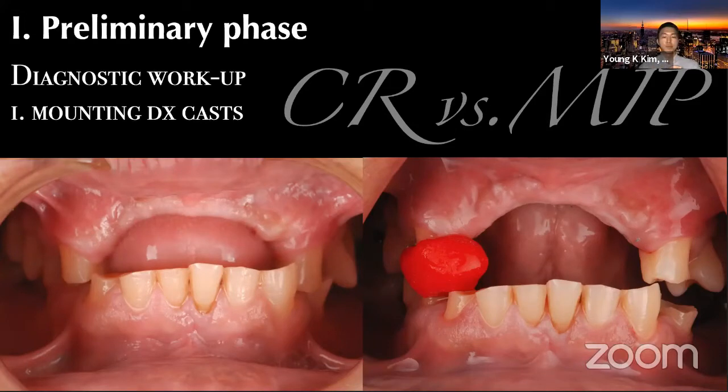So I utilize the Lucia jig technique with autopolymerizing resin, and then let it set and have a stable occlusal vertical stop on the anterior. And then for this case, I did the upper and lower scanning, and then I moved on with the digital workflow. But if you're doing conventional, you can use some of the silicone bite registrations on the posterior, and then you can articulate the cast together.